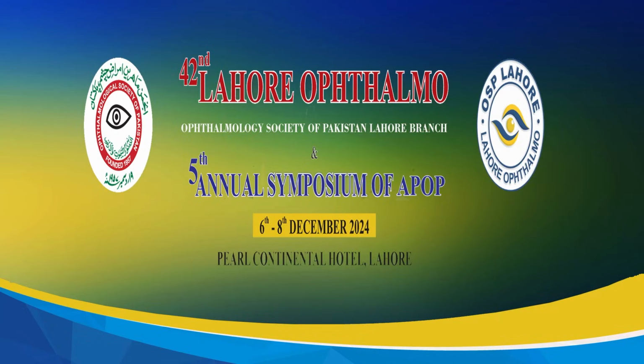होने का चांस उतना नहीं होता. वो ये तो बहुत कॉमन सिनेरियो है कि यू सी दैट स्ट्रिप ऑफ ब्लड इंफीरियरली, बिकॉज सारा ब्लड ही नीचे जाके इकट्ठा हुआ होता है. और हमारा मेन मकसद उतना बल्क विट्रियस का हटाना होता है विच विल नॉट कॉज ट्रैक्शनल डिटैचमेंट लेटर ऑन. ठीक है ना. वो सोर्स नहीं होती ब्लीड की, सोर्स तो पीछे कहीं मिड पेरिफेरी या पोस्टीरियर में होती है, वो जाके इकट्ठा हुआ होता है नीचे.